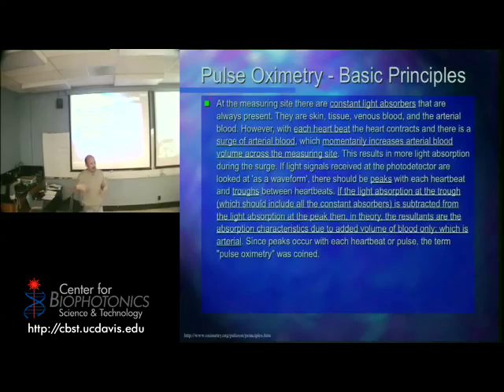You also couldn't just go out and buy a fiber optic readily. All these things were difficult, so you had to have lens systems. It was kind of annoying. It wasn't something you could readily do. But slowly they were able to get the data, and then eventually some of the technology caught up, and it became easy to do this.